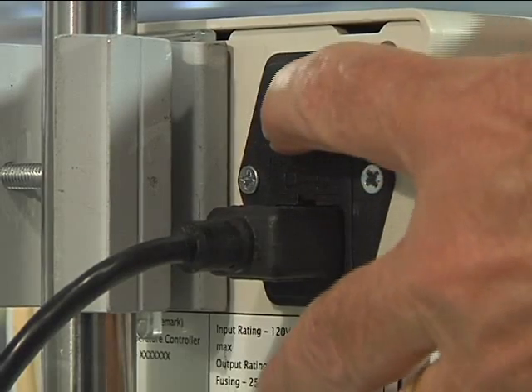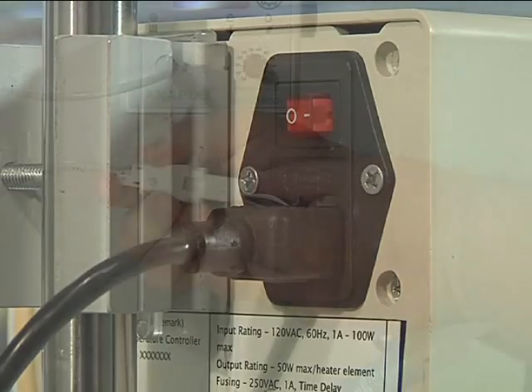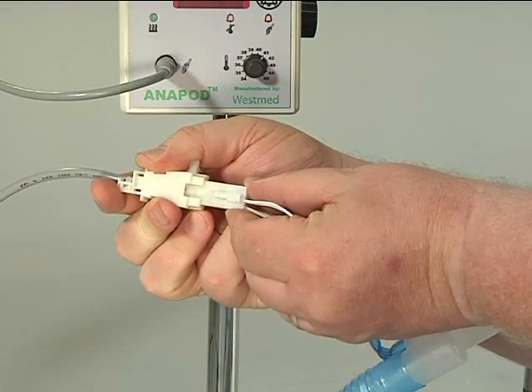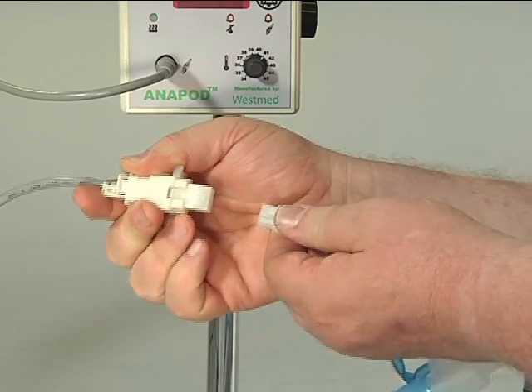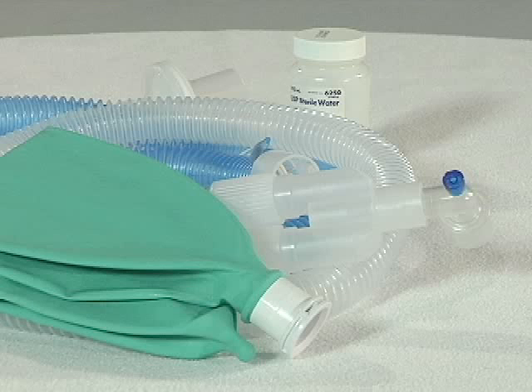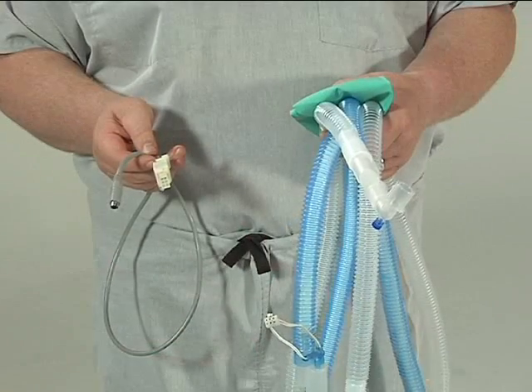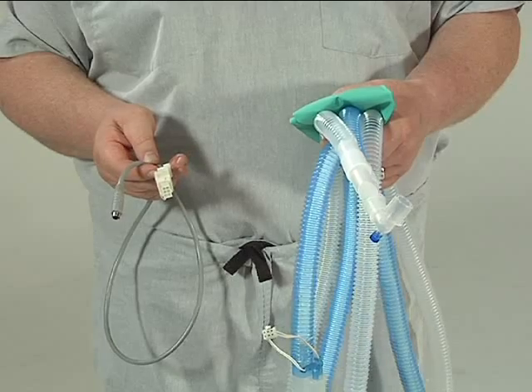To stop treatment, turn the on/off control switch on the rear of the Anapod to the off position. Disconnect the circuit from the cable assembly by depressing the latch on the white connector and separating the connectors. Dispose of the used circuit — all disposable products should be treated as biohazard waste. Note: the cable assembly is designed to be reused; do not dispose of it with the breathing circuit.